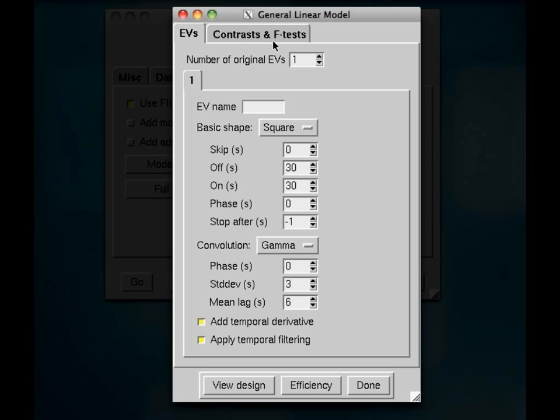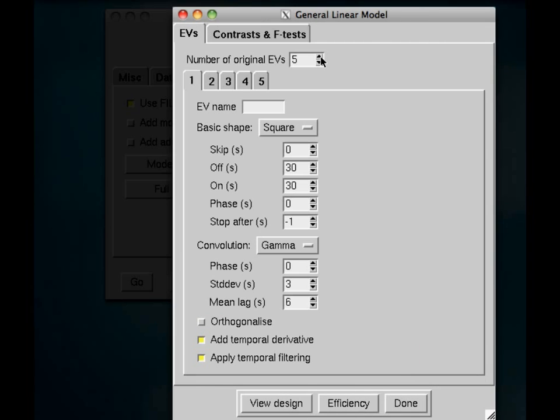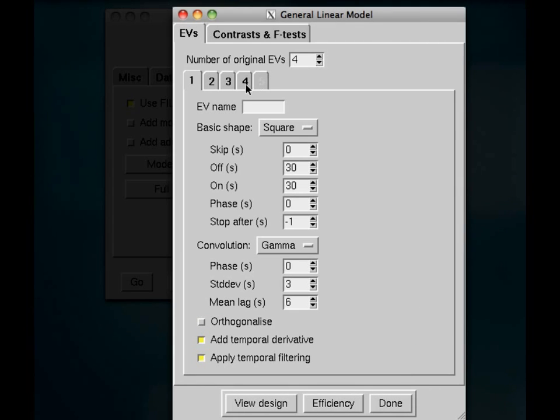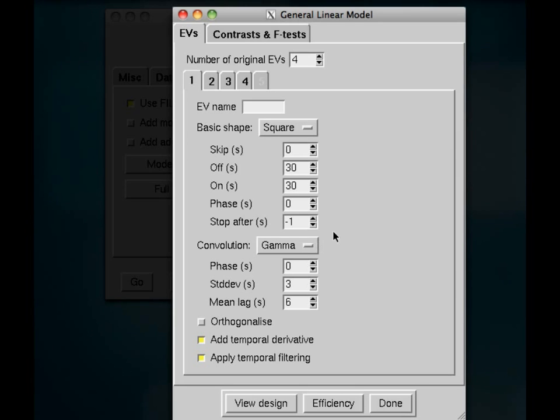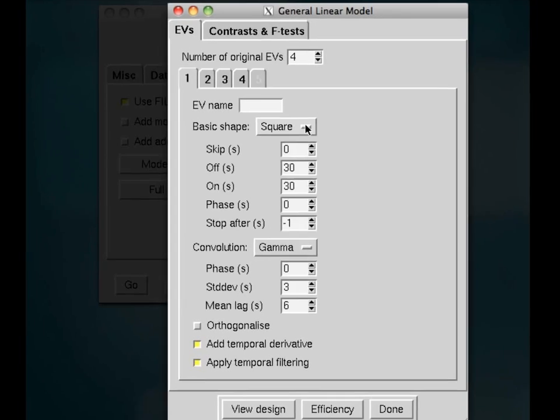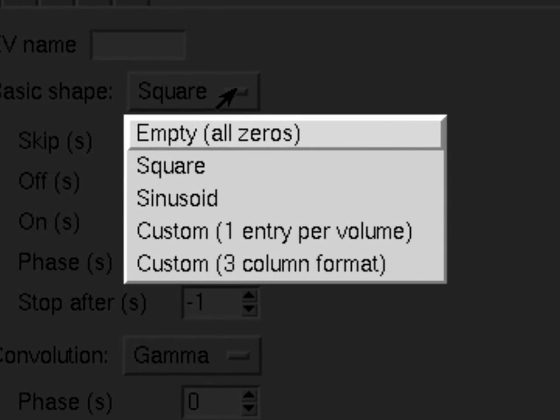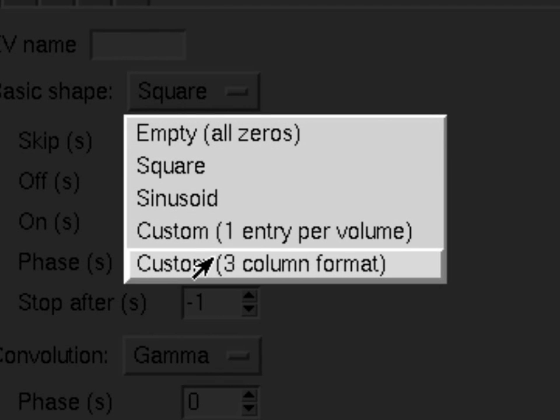In this experiment, we only had four regressors. So what we need to do is specify a name for the regressor, what kind of shape that we predict it would have, and what we want to convolve it with. Now, for this, usually it is best to select custom three-column format. This allows you the most flexibility in specifying when your condition occurred, for how long it occurred, and any other sort of auxiliary behavioral information.